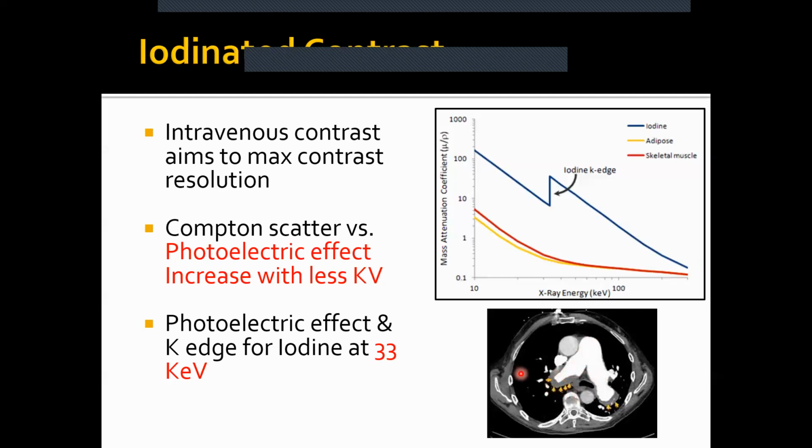Again, no spoilers there. Because these two tissues are usually very similar in the body, because it's all just artery, what you're going to do is inject iodine, which has a much higher attenuation, and that's going to help you visualize the difference between these two structures.